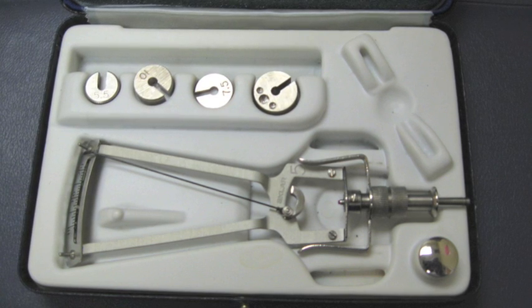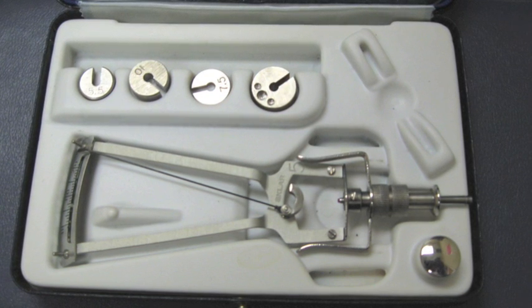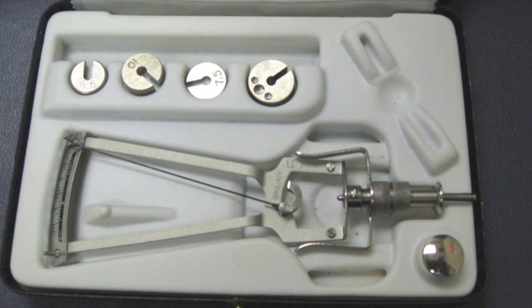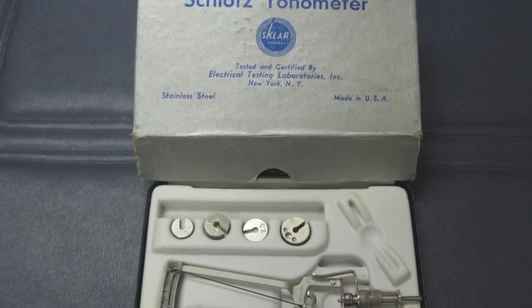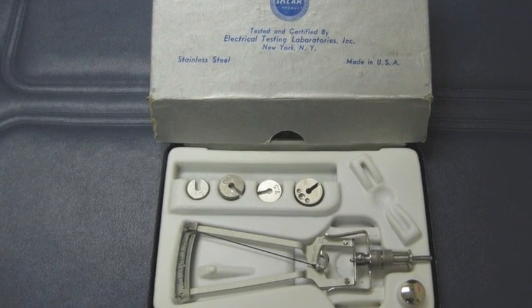Impression tonometry was the traditional method to determine intraocular pressure, or IOP. It measures the depth of indentation produced in the cornea by a small plunger carrying a predetermined weight. The Schiötz tonometer is the most common device of this kind, where extra weights can be added, and the movement of the plunger is measured by a calibrated scale.